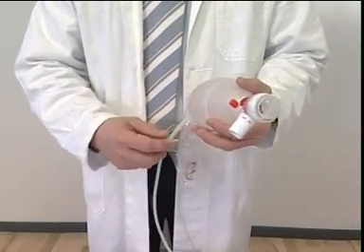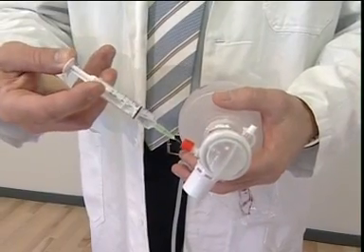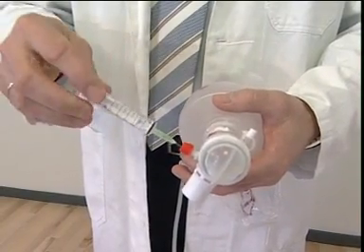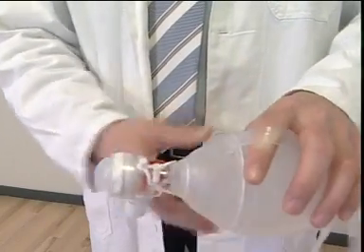Medication can also be administered by sticking the needle through the middle of the Mediport cap and injecting the medication. When medication has been injected, ventilate 5 to 10 times in quick succession.